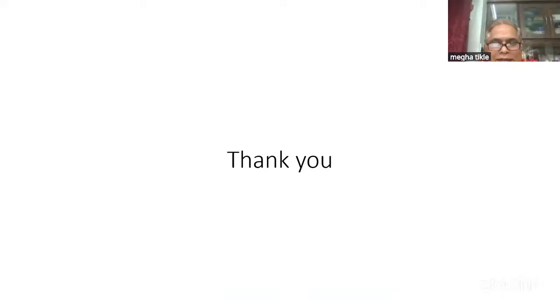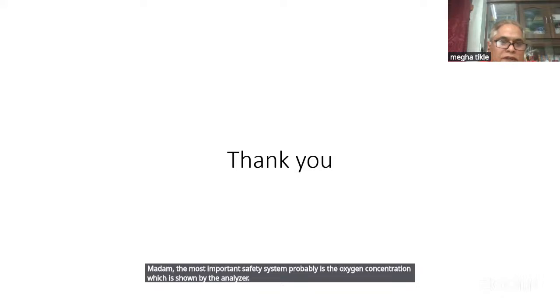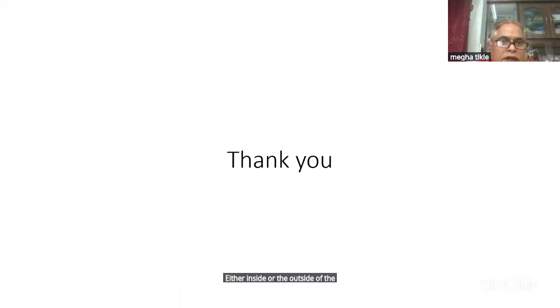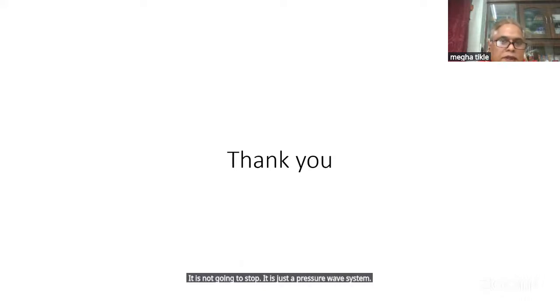Madam, the most important safety system probably is the oxygen concentration, which is shown by the analyzer. Because both of these are based on the pressure rather than the content of the pipeline. If there is a crossover, and instead of oxygen, air is flowing into the oxygen pipe and the pressure is more than 60, then also the nitrous will start. It is not going to stop. It is just a pressure-based system. So those are the limitations.